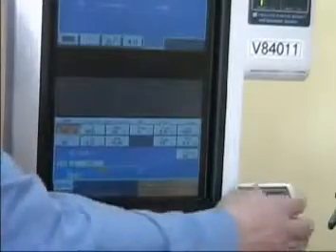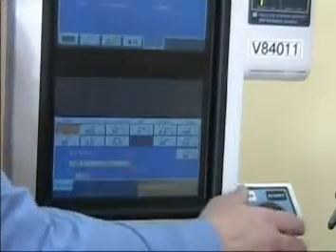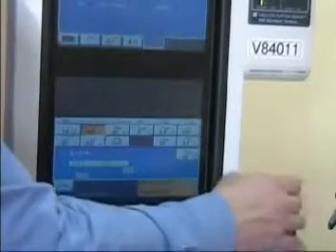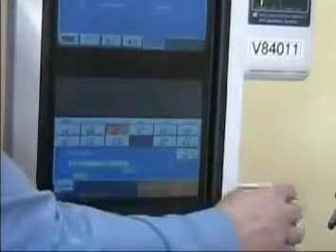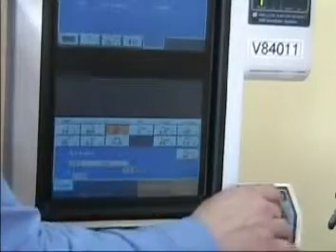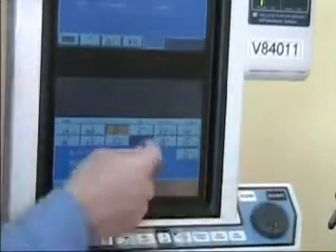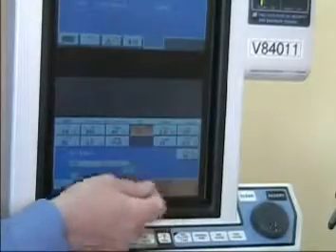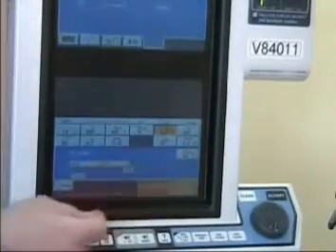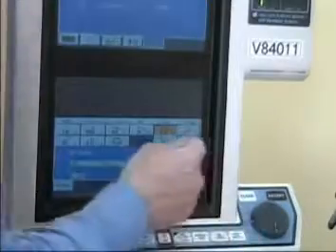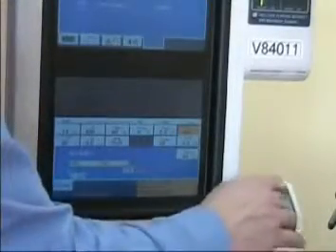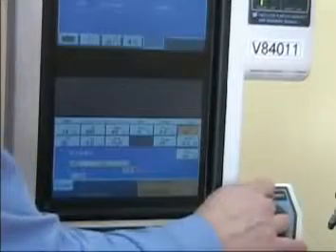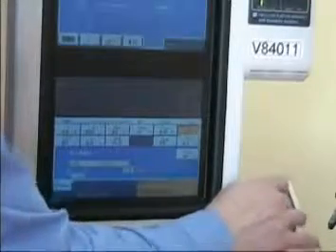Set the SIMV rate. We'll set it at 14. The volume, we want 450. And the flow, we want a medium flow of 40. Pressure support, we'll go with none at this time. Pressure sensitivity, negative 2 is most typical. FiO2, we'll start with 80%.